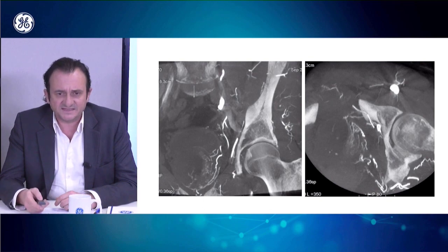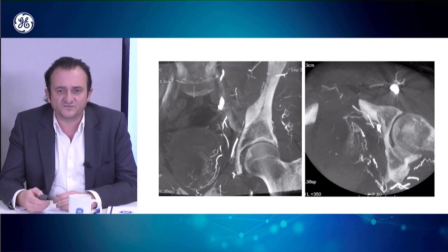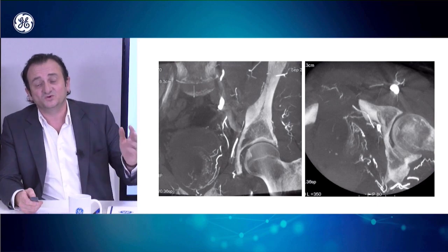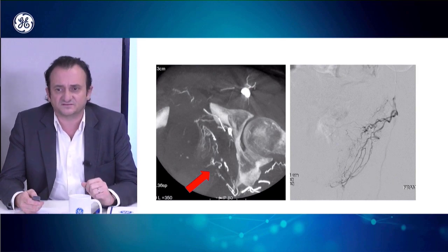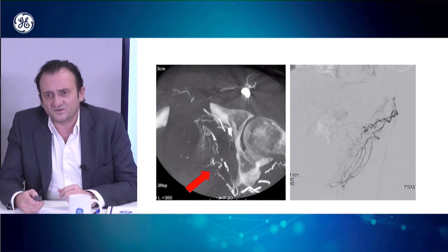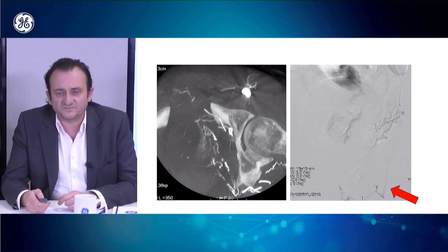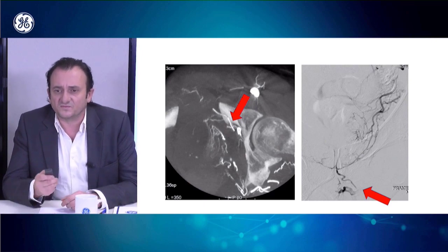On the left I will show the next artery. On the left you have an anterior view and it's more difficult to see that there are two arteries. On the right you have an axial view and you can see very well there is a posterior and an anterior artery. On the left side there are two prostatic arteries, which is not common but does happen. We begin the embolization of the posterior prostatic artery.